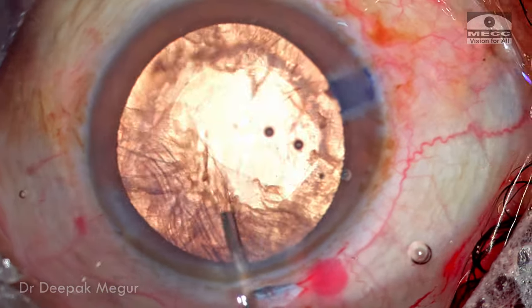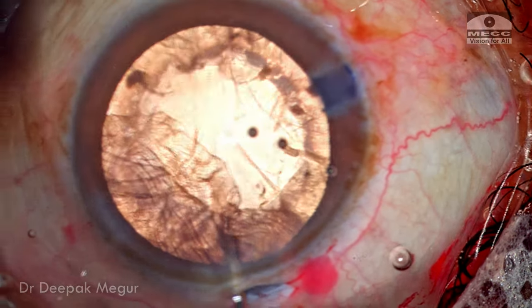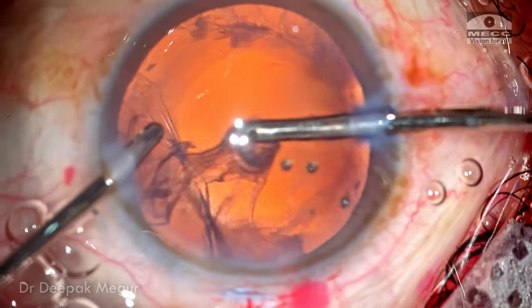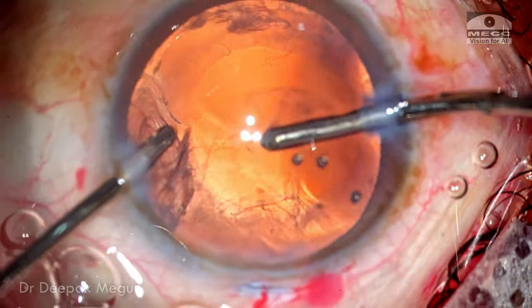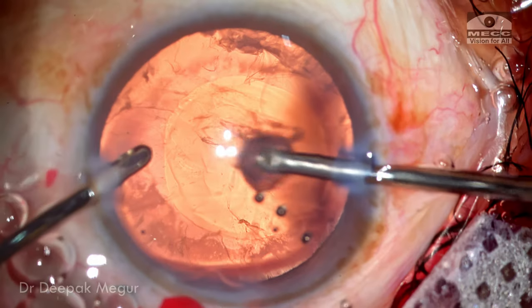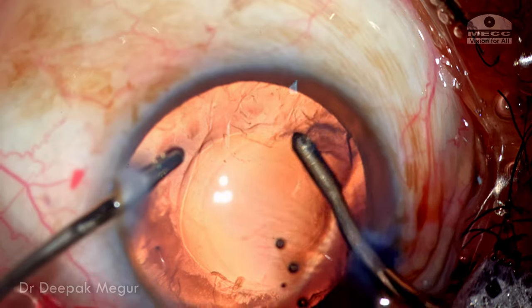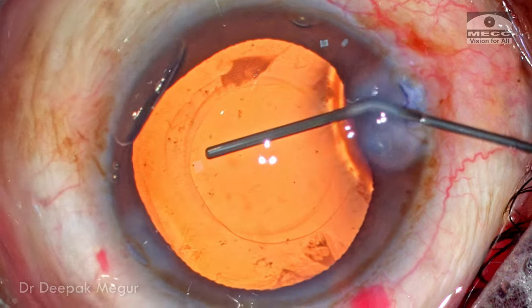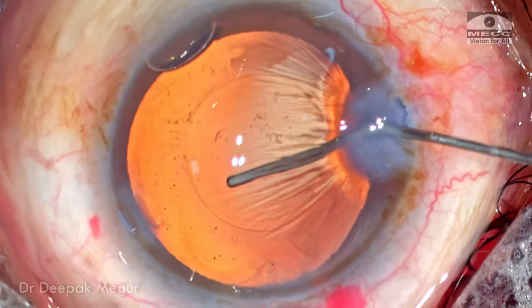Time to remove the cortex. As is customary, I'm blowing into the capsule with BSS just to clean it up. I remind myself that the case is not completed — these pathological myopes are at risk of a high incidence of posterior capsule tears, which can happen even during cortex aspiration, so I need to be a little careful. The bag is inflated with OVD as I complete the cortex aspiration. So far so good.